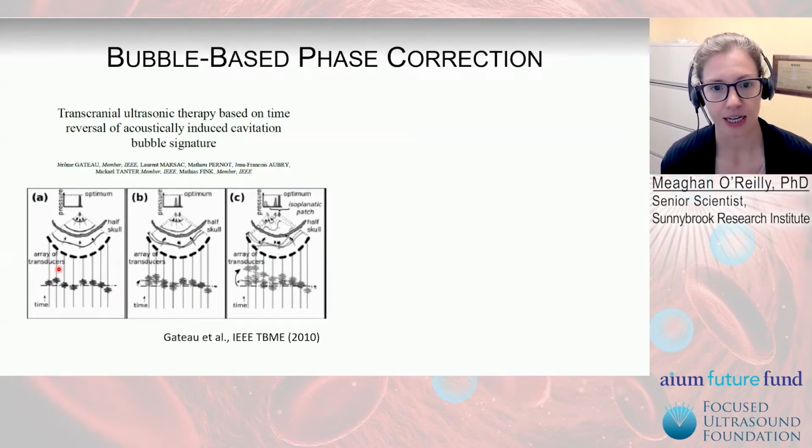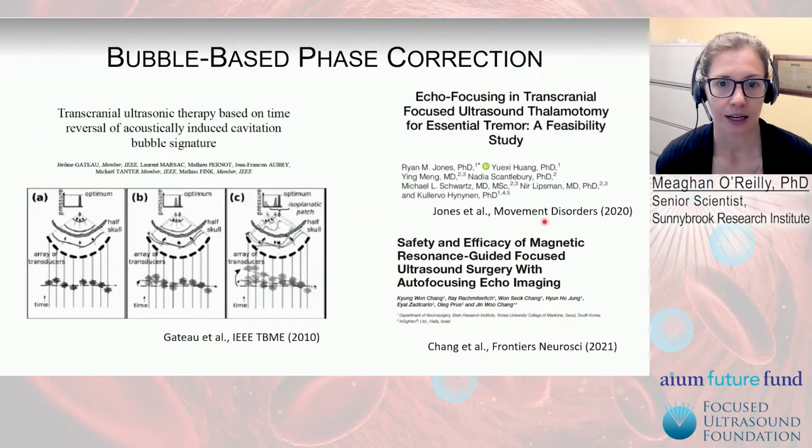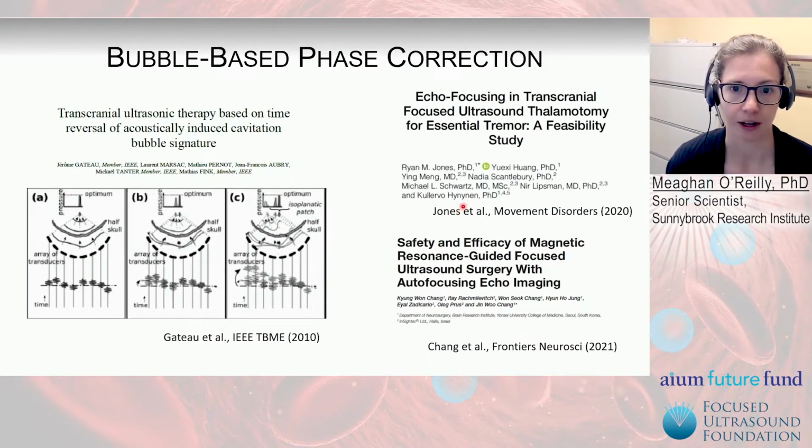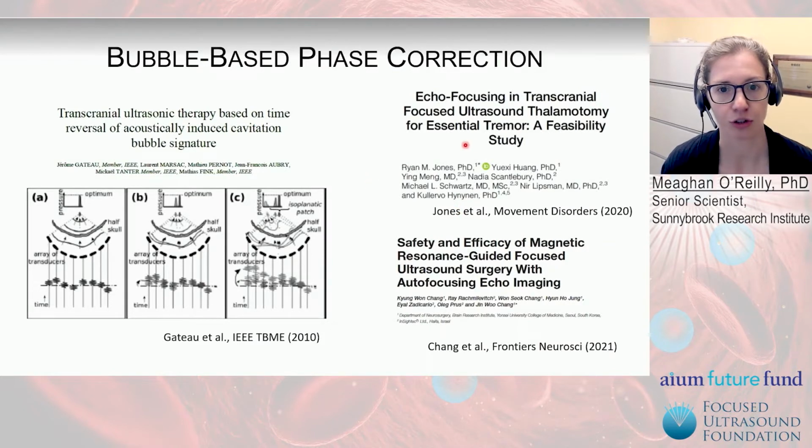And we've seen this idea now implemented by Insightec in their clinical device and tested in patients. And so there are two recent studies describing the clinical use of this sort of auto-focusing type approach.